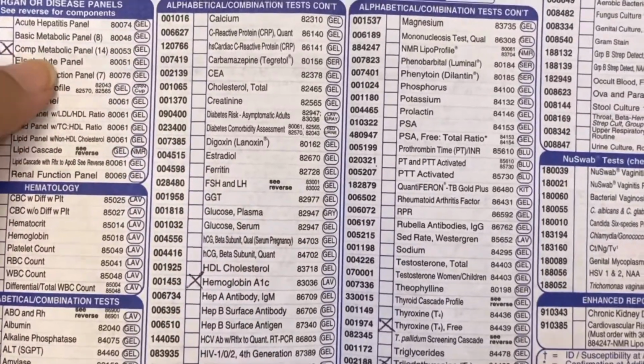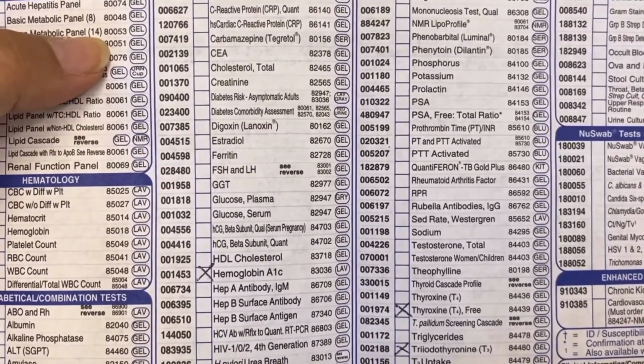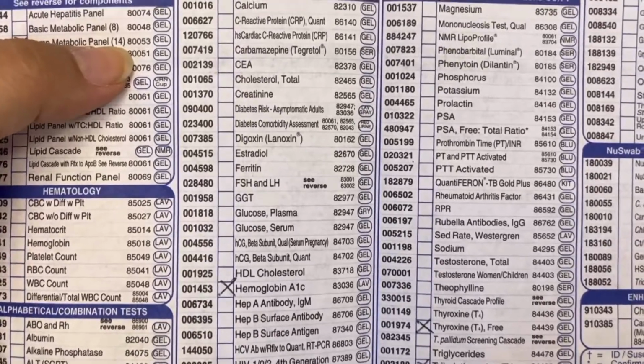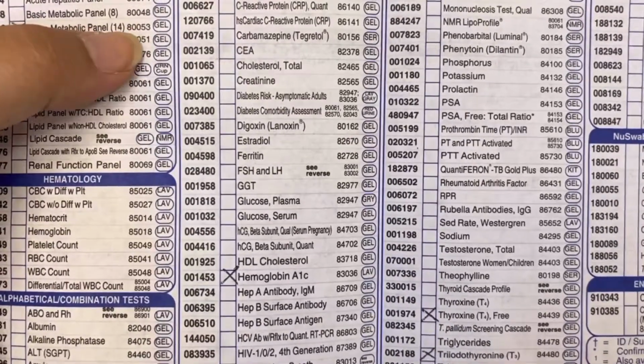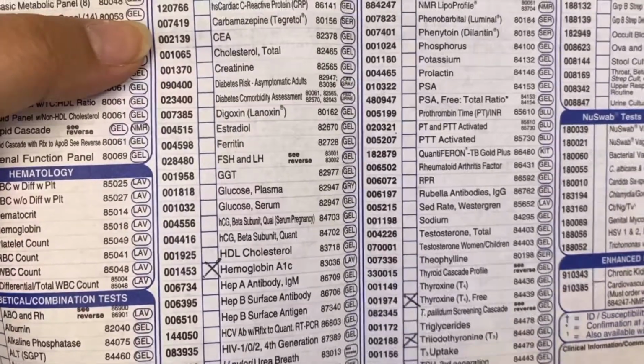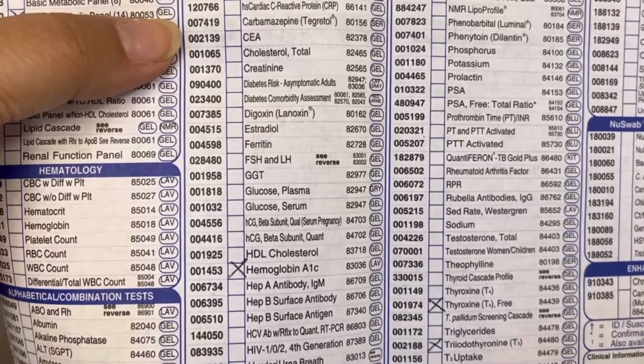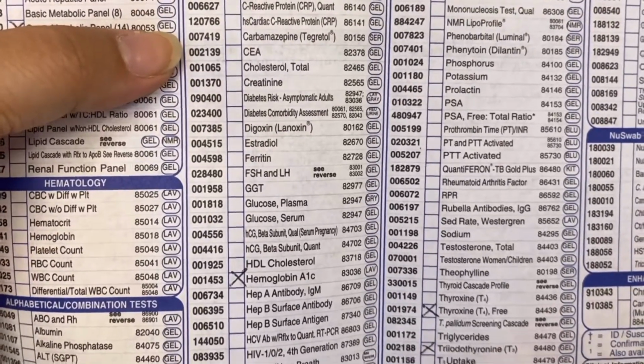Okay, CMP, it says 14 here because there's 14 different things that they check, and it goes into a gel separator tube. That is either a tiger top, a gold top, or a mint top.